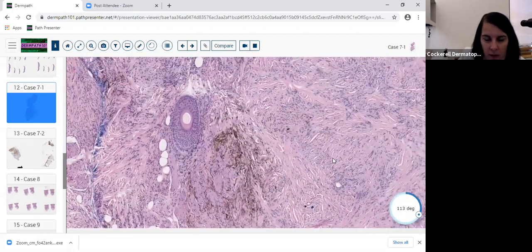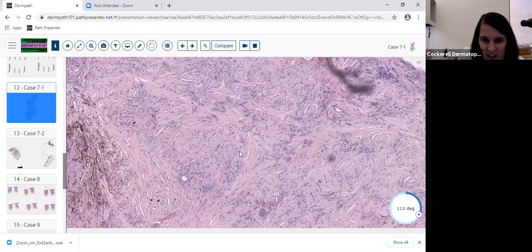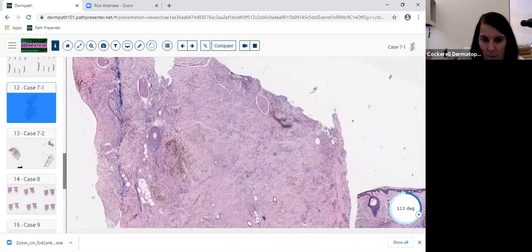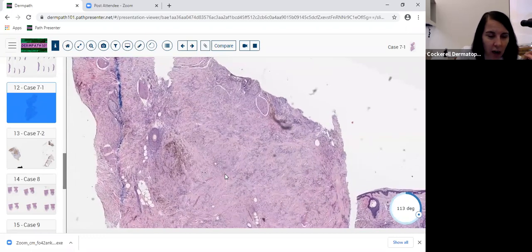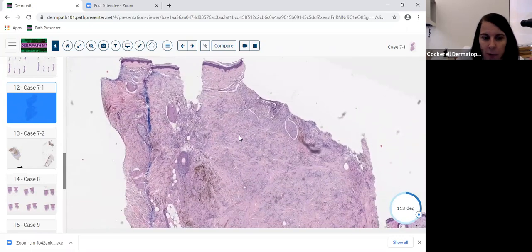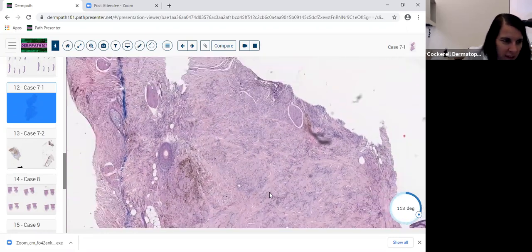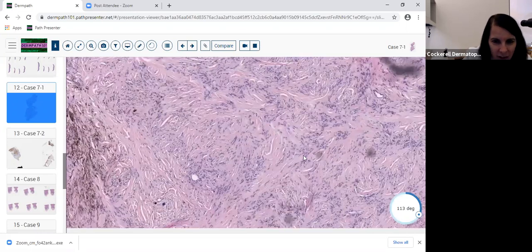But they'll show you a more cellular blue nevus than this. This is more sclerotic, but they'll show you a very cellular one, and they might be bulging into the panniculus, and they're going to try to get you to overcall. So be careful. Use your criteria of necrosis, high mitotic rate, and an intraepidermal component. And it could be an atypical blue, and that's fine. You could call it an atypical blue. But atypical blue isn't a malignant process. It's atypical, and they can rarely metastasize.